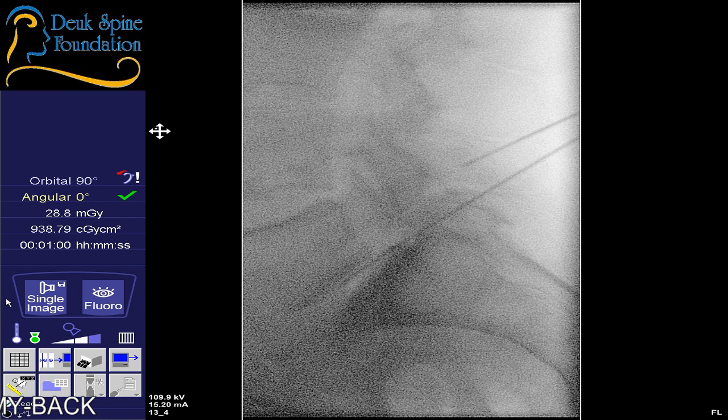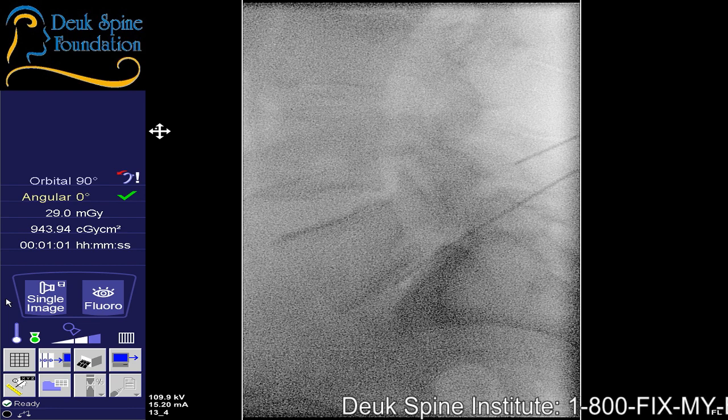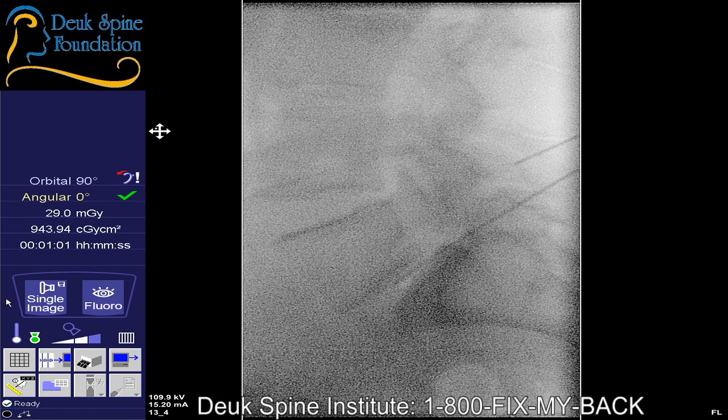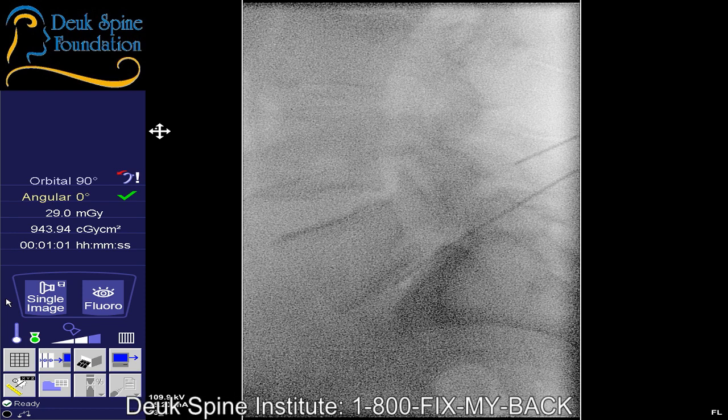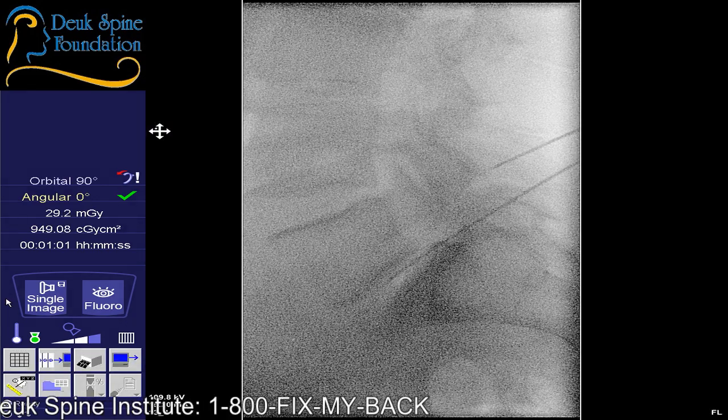Let's get that L4-5. I need the fluoro lower, or I need the table up. Is your fluoro all the way down? Yes. Shot. And I want that L5 superior end plate lined up perfectly. How come we're so grainy? Is it because we're pulsing? Okay. That's fine. I think we're okay. You know, trajectory isn't so bad actually from here.